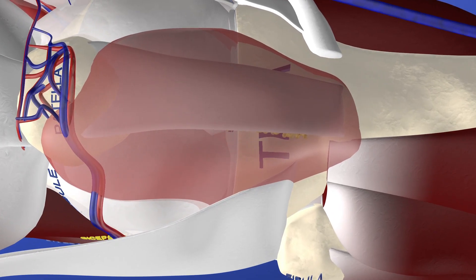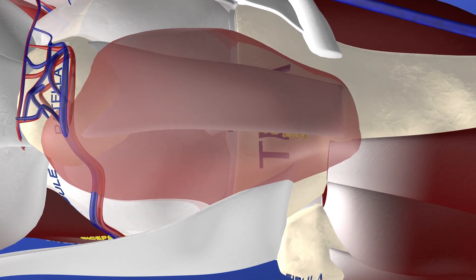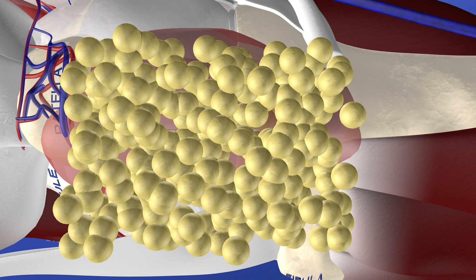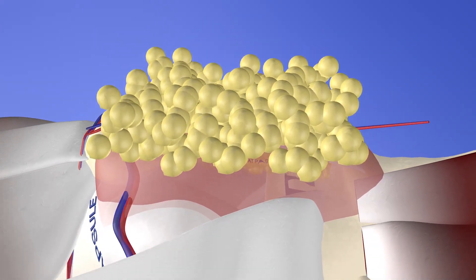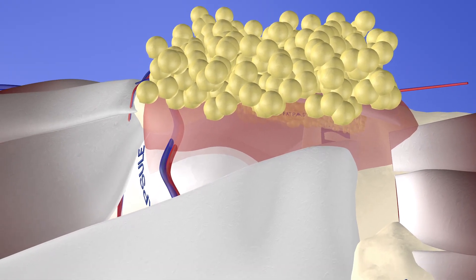Here we are zooming in to get a better sense of it. Here's some subcutaneous fat on top of this lesion, which was sloughed or separated from the underlying layer, causing this potential space that became filled with fluid.